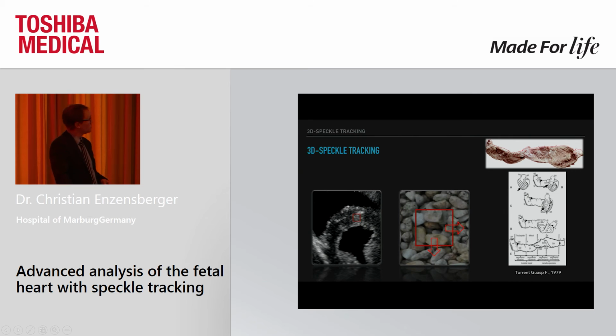As Dr. Zimmer already said, when we think about the fact that the myocardial architecture is very three-dimensional, then maybe it does not make much sense to measure this by a two-dimensional method.